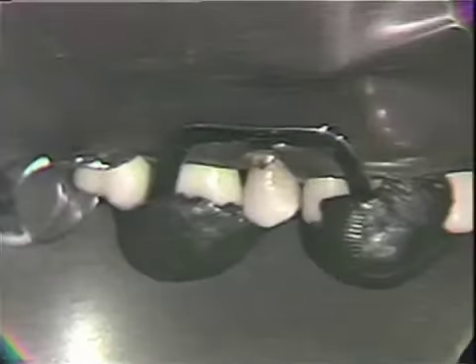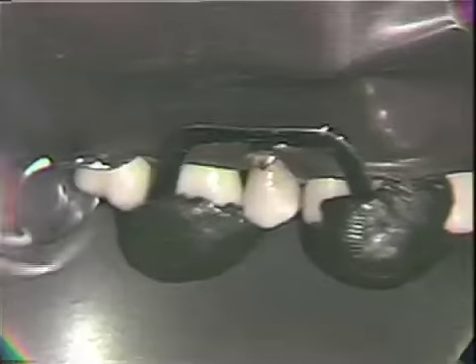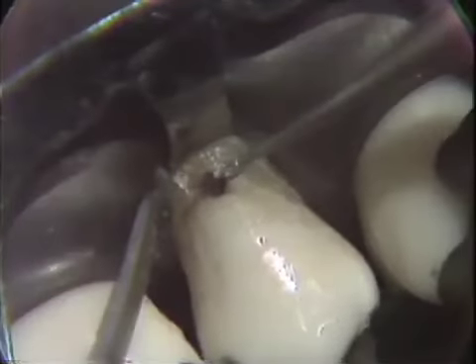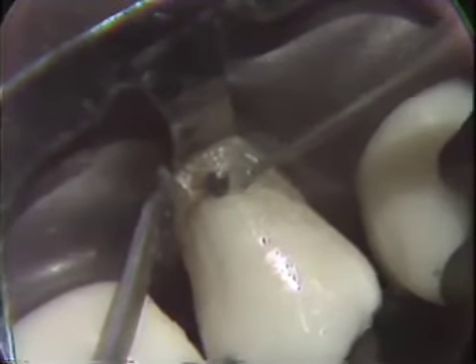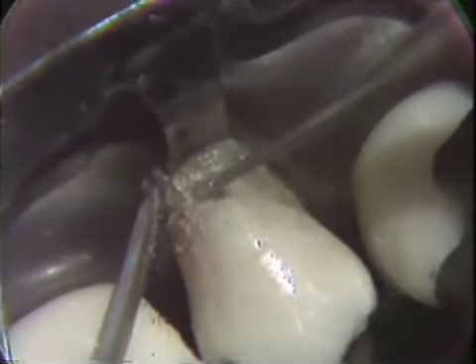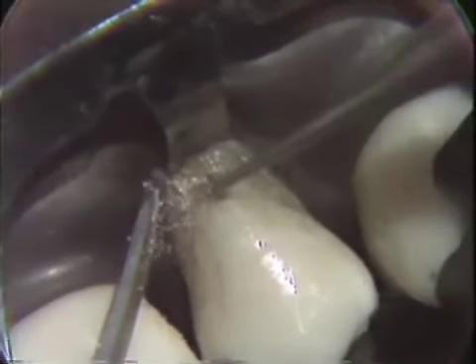We want to do that same thing with the distal wall. I've moved now from the 11 o'clock position to a 7 o'clock position in order to carry on with the preparation of the cavity, and we'll be starting in the carious lesion area, and again with the base of the burr, beginning to establish the distal wall of the preparation.